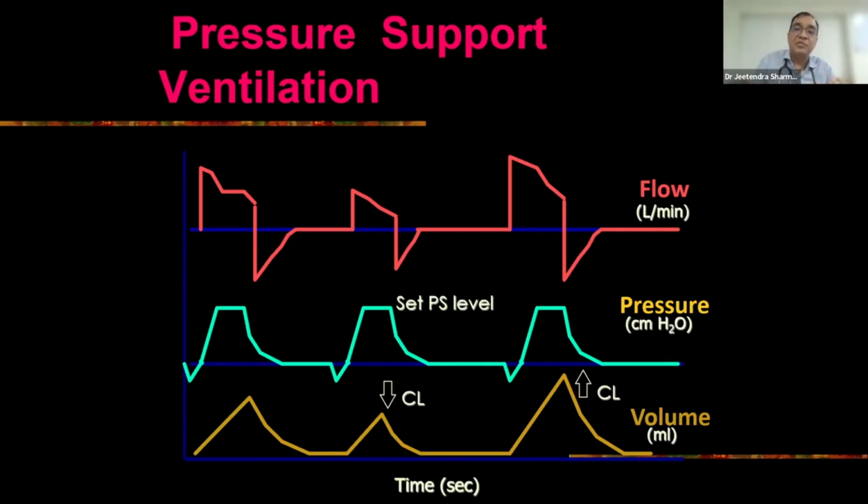And if the lungs become absolutely like the previous one in 6 hours and nobody is seeing this patient, it probably goes to a 900 tidal volume, and the patient with the pneumothorax may die. Why did the patient die? Because he was getting better. That's the reason for his death. So it is a combination of he's getting better and nobody is seeing and actually taking the call to reduce the pressure to see the volume. That's why both things can happen.